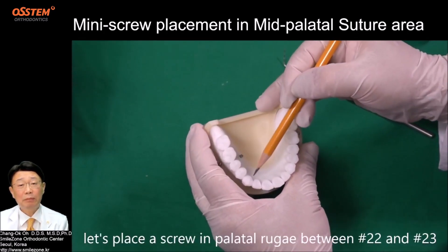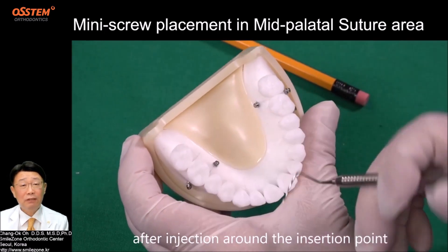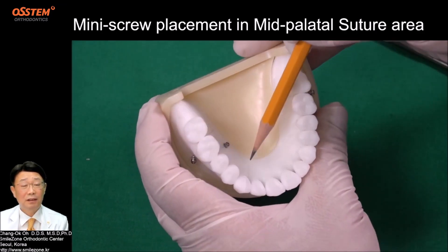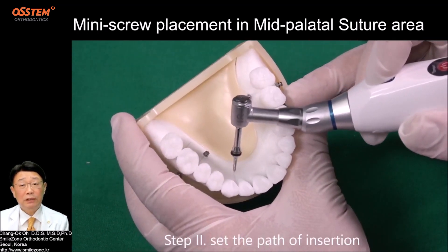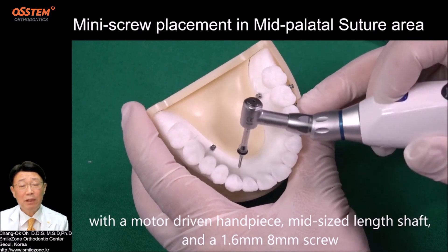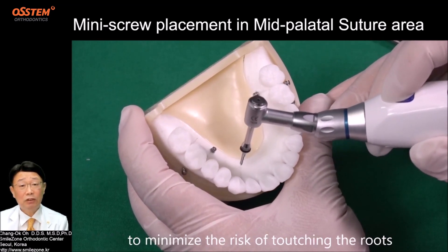Let's place a screw in the palatal rugae between teeth 22 and 23. Step 1: Determine the insertion point. After injection around the insertion point, with a probe, press the tissue to mark a line. Step 2: Set the path of insertion. With a motor-driven handpiece, mid-size length shaft, and a 1.6 mm, 8 mm screw, aim distally and straight to the center between the roots to minimize the risk of touching the roots.